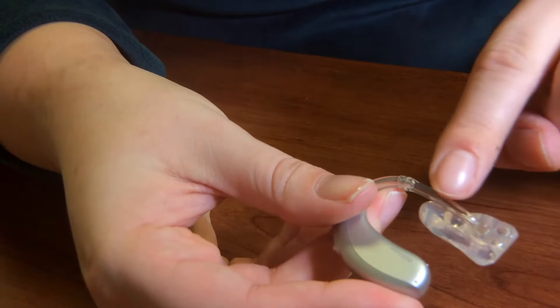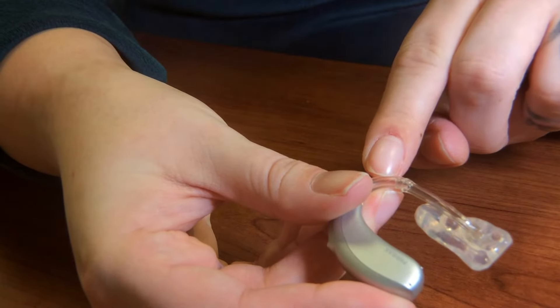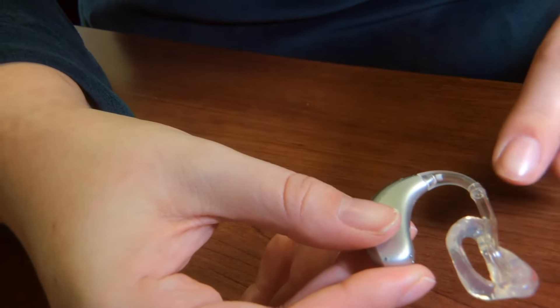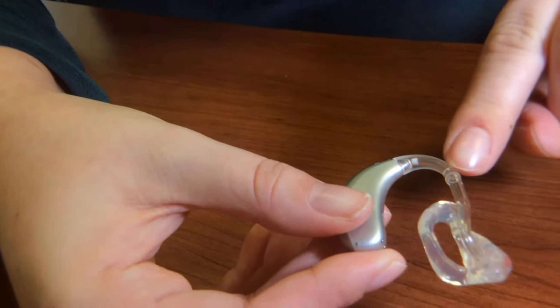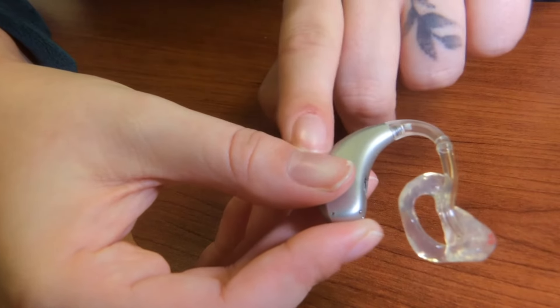This is the tubing. It connects the ear mold to the tone hook. This is the tone hook. It connects the tubing to the body of the hearing aid.